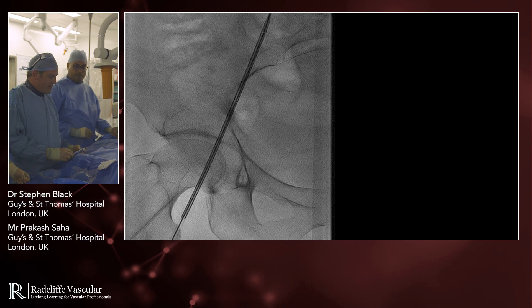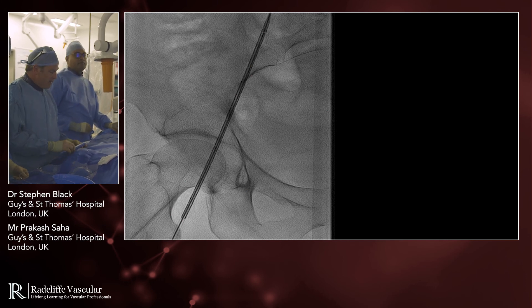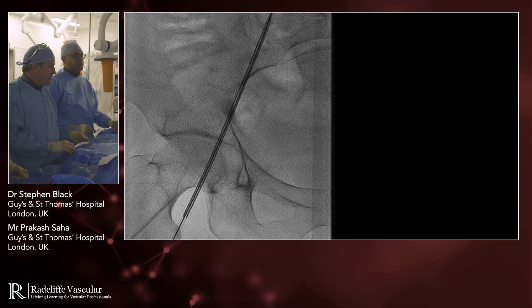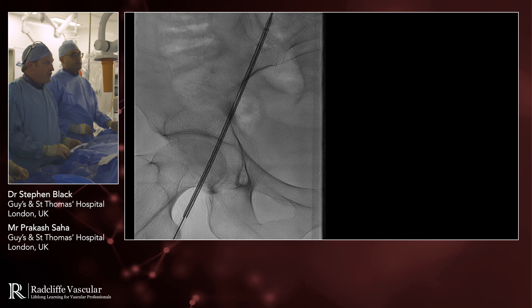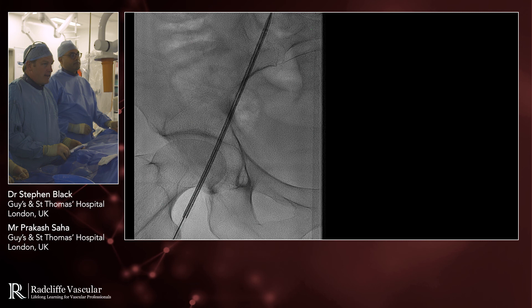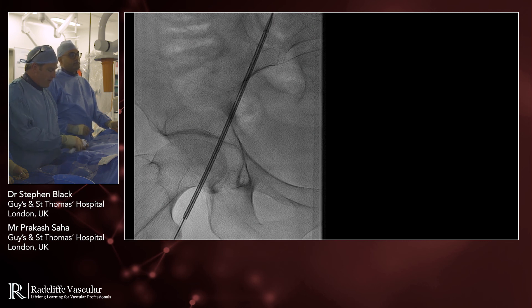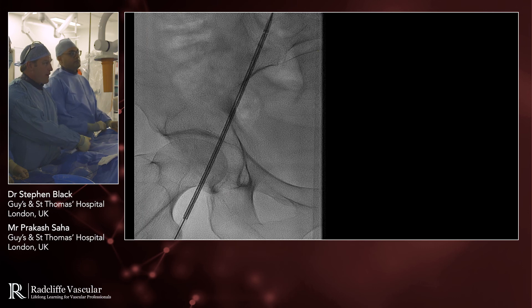This is the Ubre stent. It's got a red tag on it, which is a lock that you remove before you deploy the stent. We've checked at the top end that the stent is completely in the sheath, and by using our landmarks, we've marked the bottom end of the stent. It looks like we've got a pretty good landing place there for the stent at the bottom end. With this tri-axial system, you deploy with your thumb.